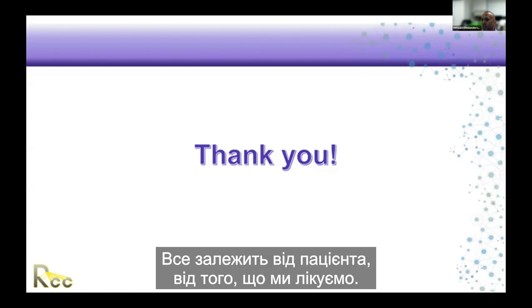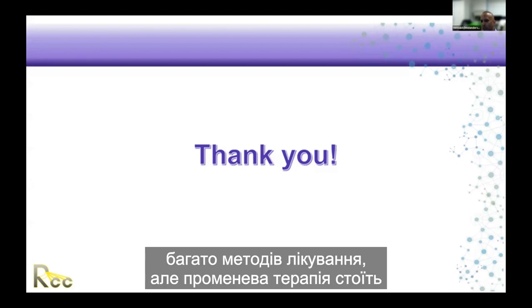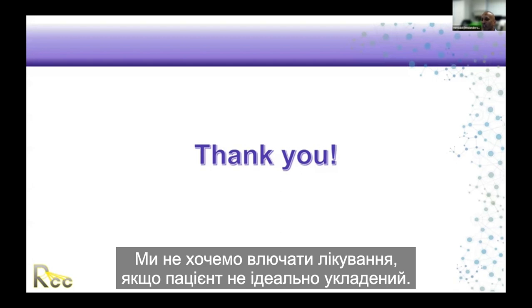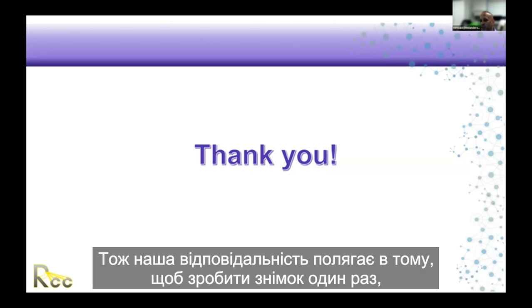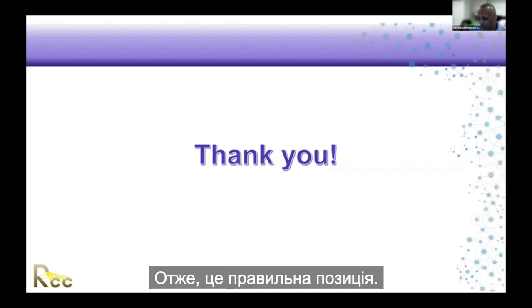What are we treating? It all depends on that patient, what we treat, all that stuff. But like I said, at the end of the day, the radiation treatment comes first. We don't want to beam unless the patient is perfect. So you have to use your resource of either KV or CBCT to image them. Our responsibility is to make sure that you image them only once, not repeating.